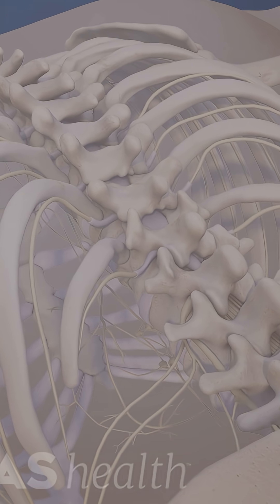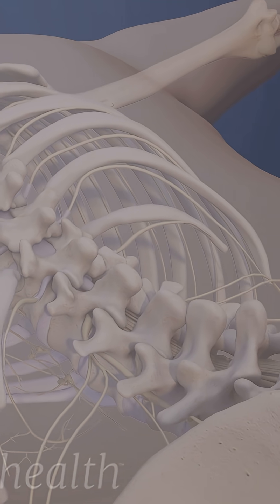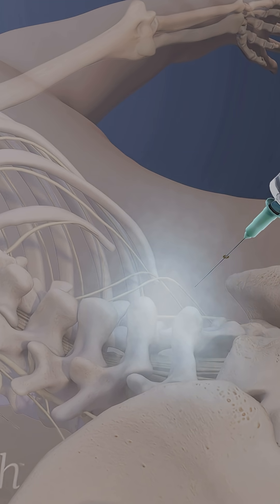Vertebral nerve ablation begins with the patient lying face down on a table. Relaxing medication is given to produce sedation. A local anesthetic is then injected into the skin to numb the tissue in the targeted area.